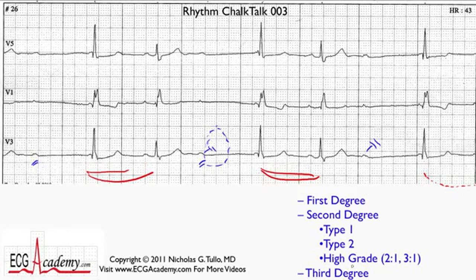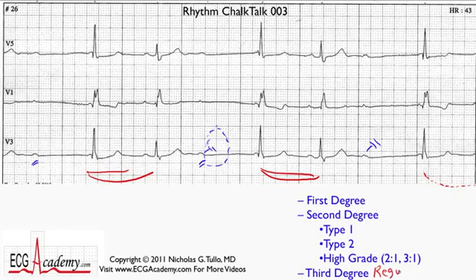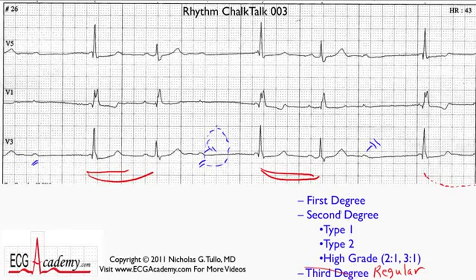In order to have third degree AV block, none of the P waves should be getting through. If none of the P waves get through, then the ventricular rhythm has to be some kind of escape rhythm. Usually a low junctional focus or an idioventricular focus will arise as an escape rhythm, and the QRS complexes will be regular. These are not regular, so we know third degree AV block is not present. And it's clearly not first degree because some P waves are failing to conduct.